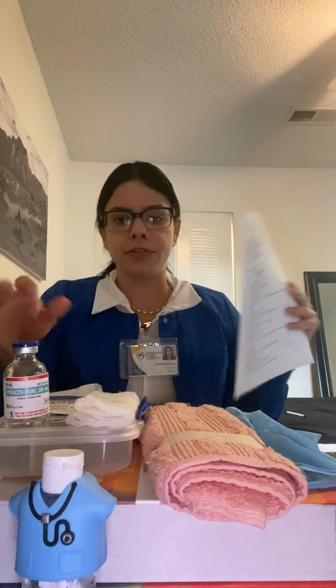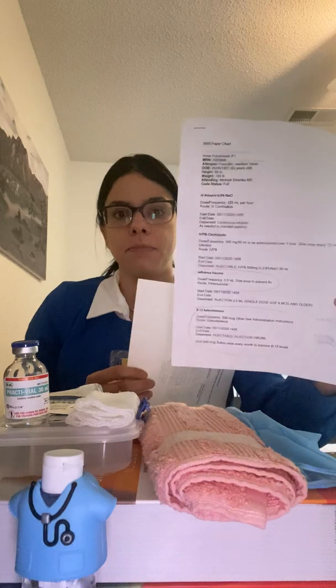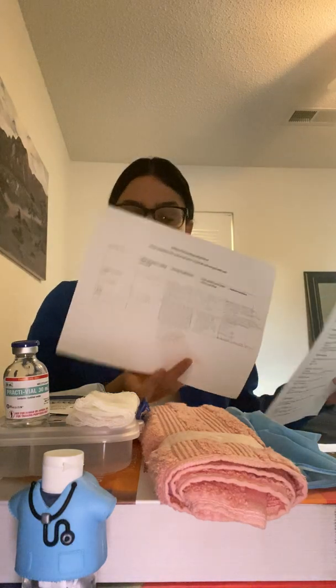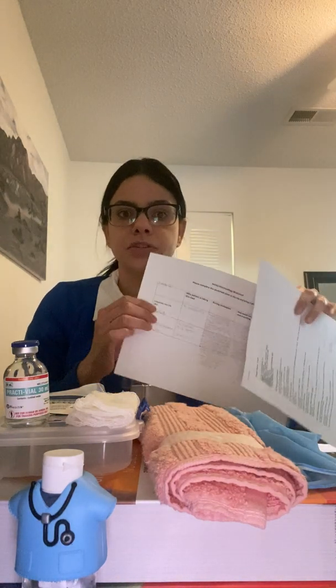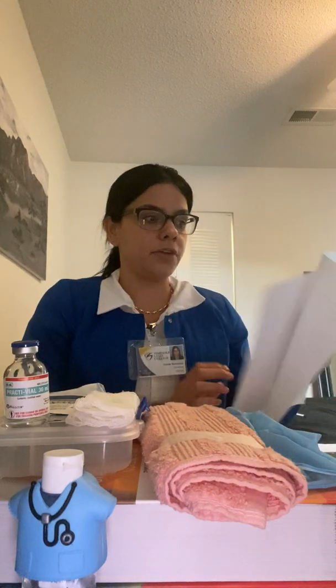Before I start, I just want to point out these are all the stuff that I'm going to be using, along with my medical record for my patient and the medication that I'm going to be administering. In this case, it's going to be the flu vaccine. And these are all the nursing implications and all the stuff that I need to consider for my patient.